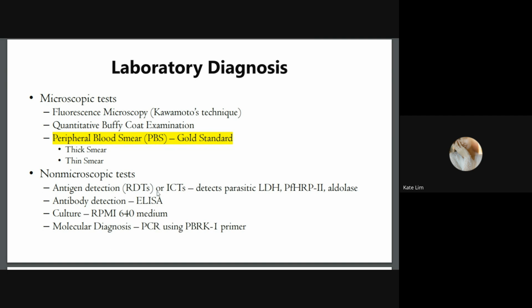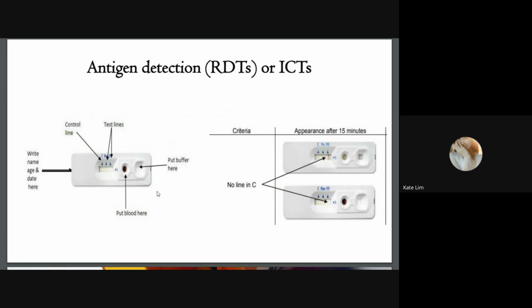So this rapid diagnostic test right here is a simple, quick and effective tool to detect Plasmodium species, especially in resource limited settings, especially here in the Philippines. So, not all the time there is a medtech on duty, and not all the time there is a medtech who can examine PBS.